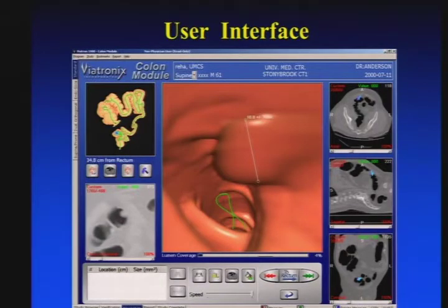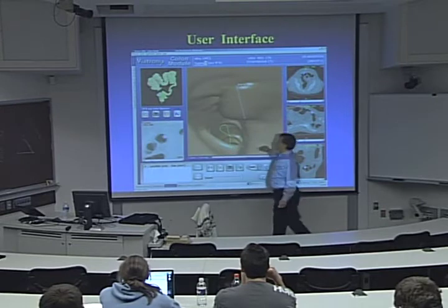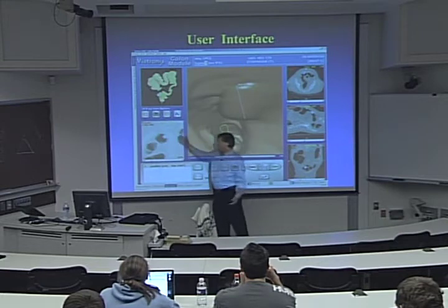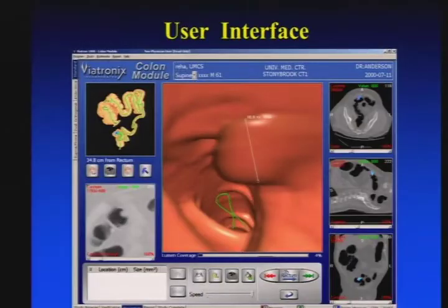The user interface that we developed for the doctors looks like that. It's a relatively simple one. You have in the middle this endoscopic view. That's the main window. We have the sagittal, coronal, and axial views here with a lot of data. For example, we are at location 118, 222, 185 inside this volume. You have the 3D model reconstructed with a 3D cursor. This 3D cursor also appears in there. And we have here a view just in front of the camera. And a very few buttons. That's all the doctors wanted.